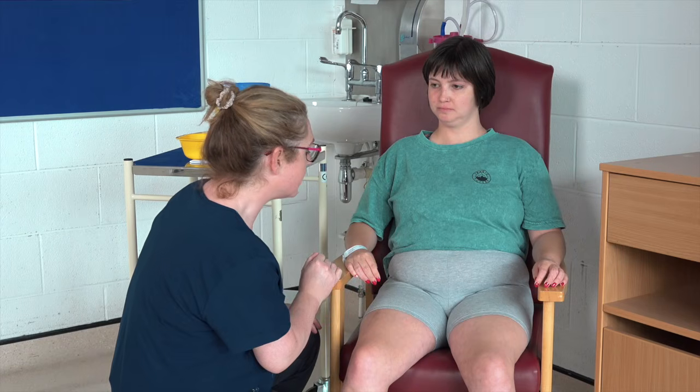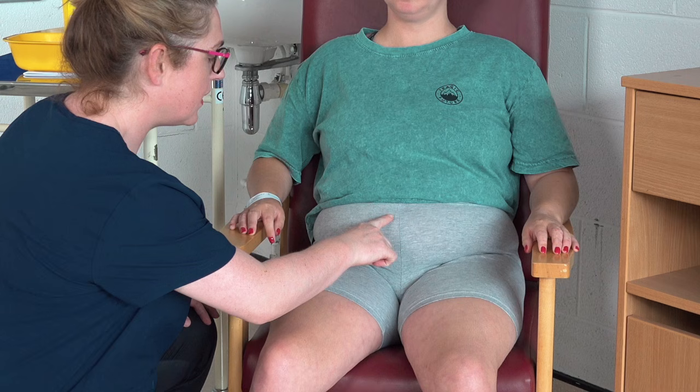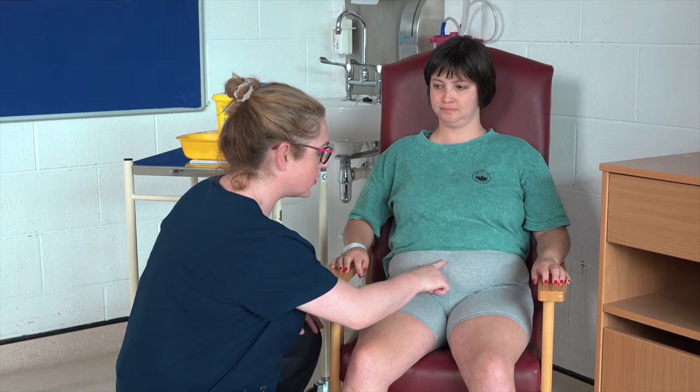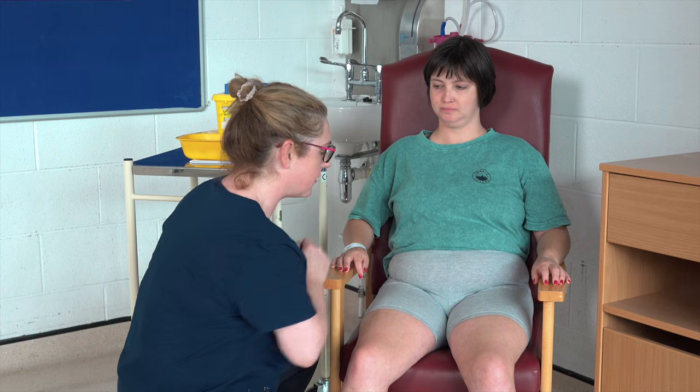The area around the umbilicus is a site for a subcutaneous injection. Check the site for signs of edema, infection, or skin lesions. If any of these are evident, select an alternative site. Avoid injecting within a 2-inch radius around the umbilicus.